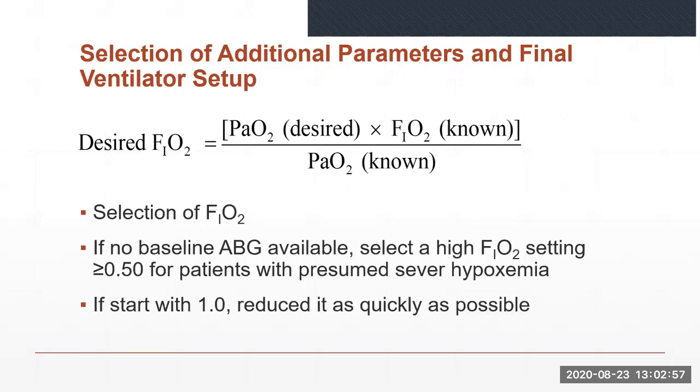It is important to know, however, that 100% oxygen should not be withheld if the patient is seriously ill and requires a high FiO2. Any procedure that places the patient at risk of developing hypoxemia should be performed with the patient breathing 100% oxygen. For example, administering 100% O2 before and after suctioning and also during bronchoscopy is a common practice.